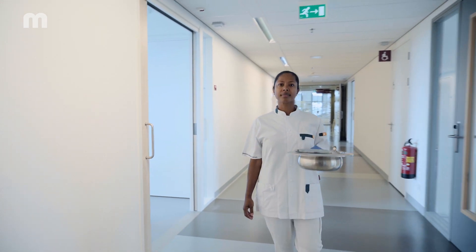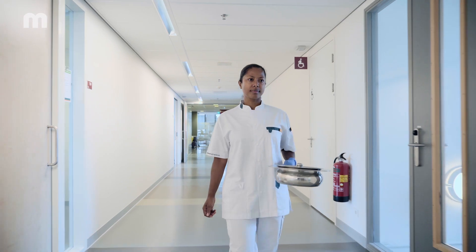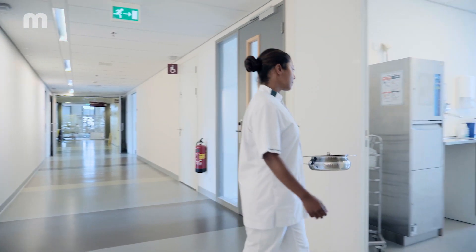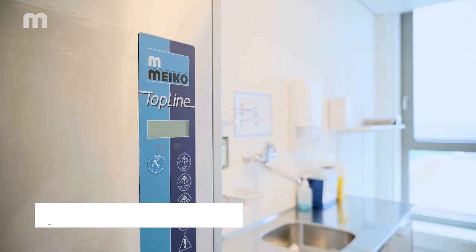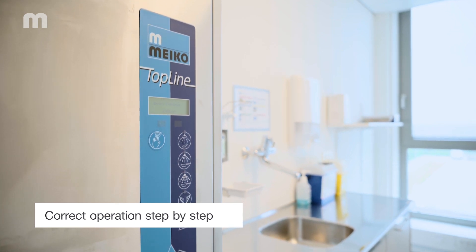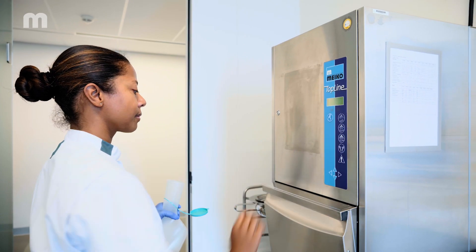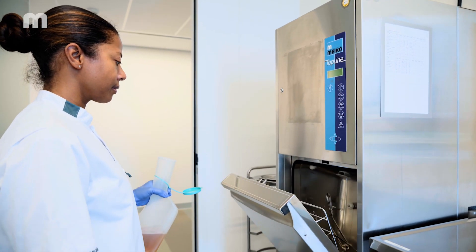Carry the filled care utensil into the dirty utility room with one hand while wearing a glove. Open the door to the room with the bedpan washer disinfector with your other clean hand. The door of the bedpan washer disinfector can be opened with the foot switch or by holding your hand up to the sensor.